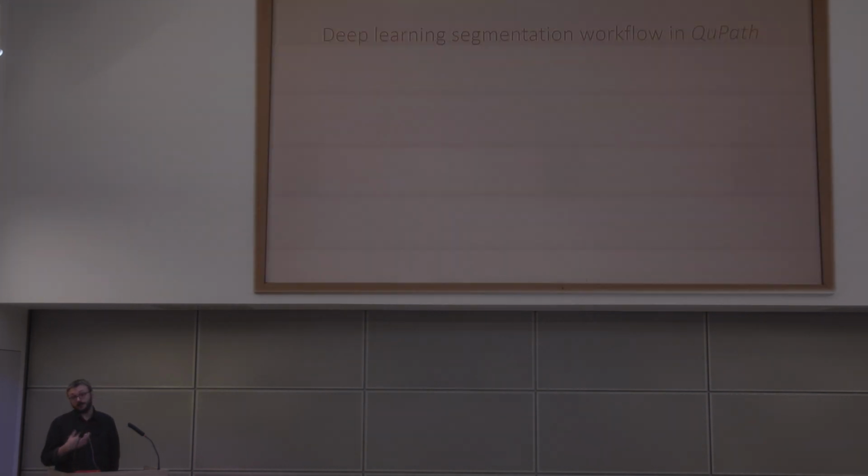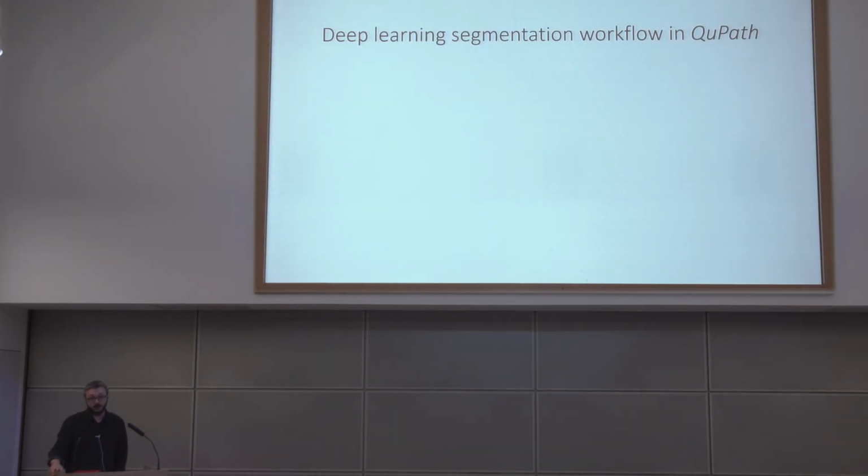I have a blog where I post scripts for things which are a bit more established. I try to get the balance between documenting things, but also then I might change them. And what I'm finding is I change things, and I spend a lot of time trying to answer questions about how to update your scripts to make them work. It's my own fault for changing things, but the reason for changing it is to try and make it easier in the future, which makes me a little bit more reluctant to put things on whenever they're in quite such a fragile state as this. But this is where it's going.